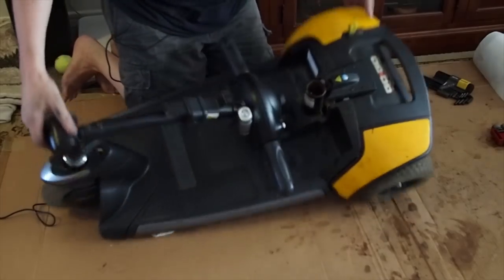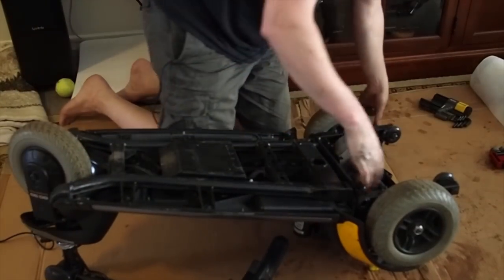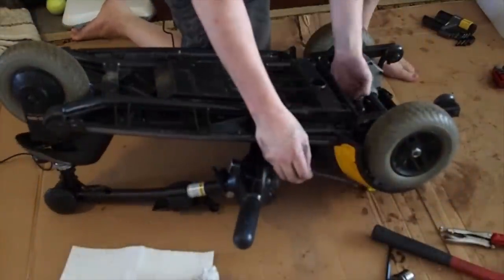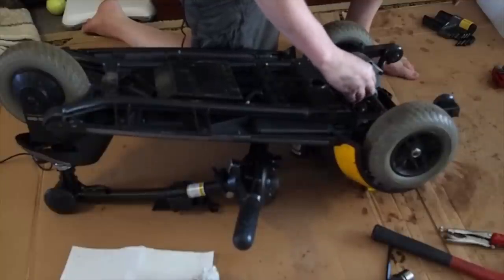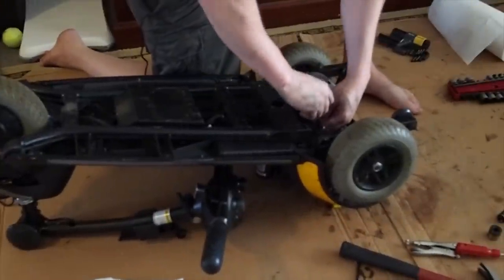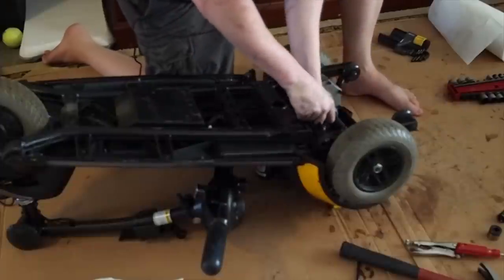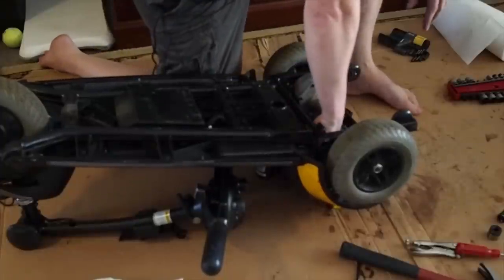Now that they're together, I'll turn this over and I will just tighten this connector up so that they're together. These bolts don't have to be super tight, just enough that they don't come out. I think one time I took this apart, I put everything back together with Loctite, but I think that's a little bit of overkill. It's not really necessary. It doesn't hurt anything. It shouldn't make it much harder to take apart.